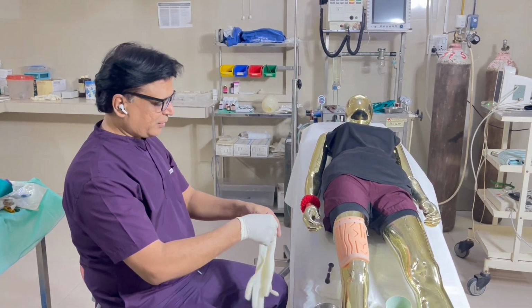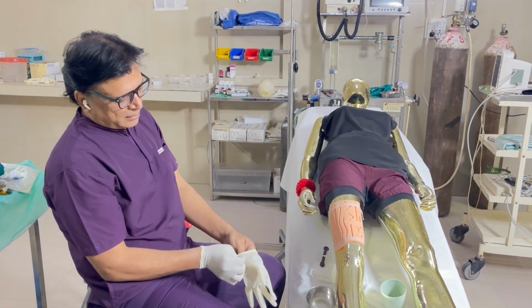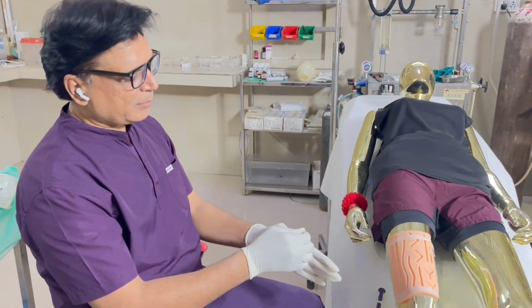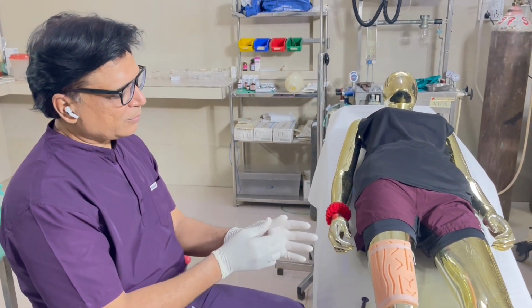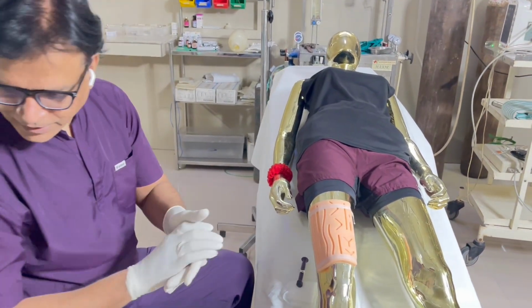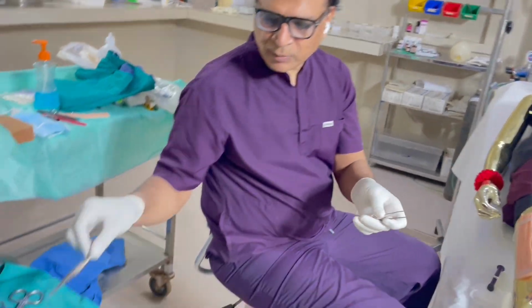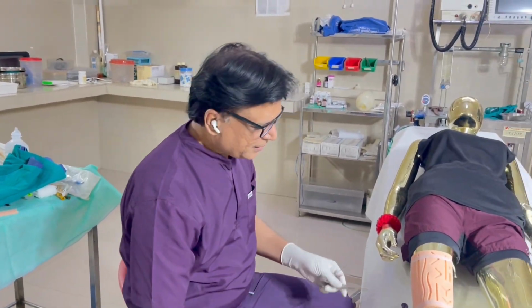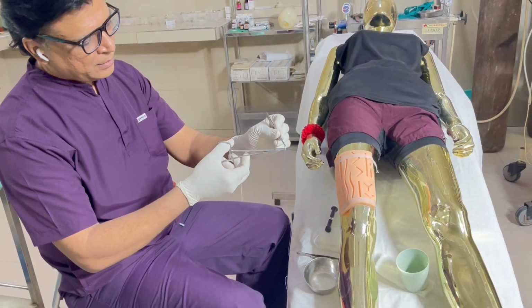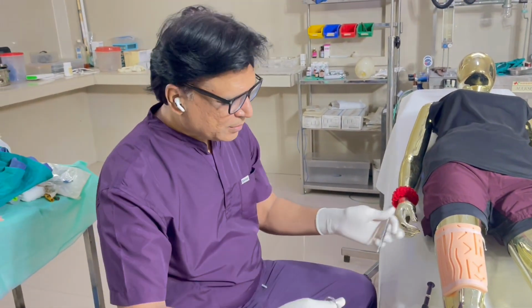So what you will be doing, first of all I will be demonstrating a vertical mattress suture. This is the skin pad, the suturing pad. The instruments I take: this one is the plain forceps, this one is the tooth forceps, this is the needle driver, and the suture, this violet color means Vicryl.